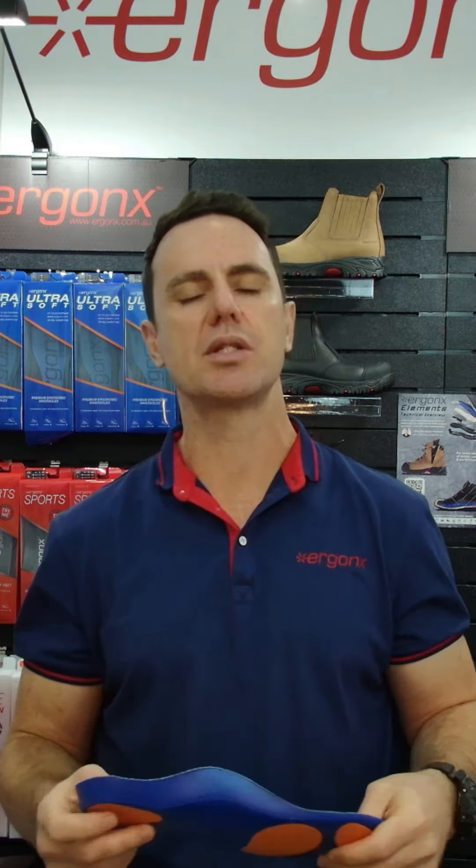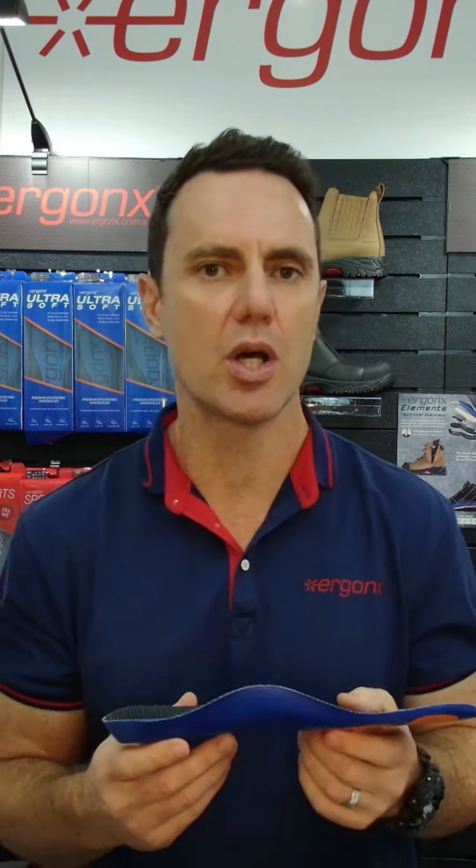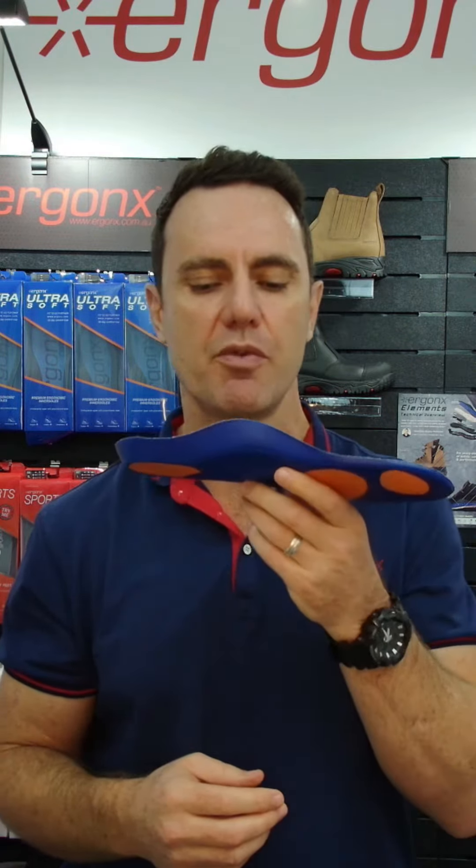How to choose the best orthotic inner sole in under one minute. Hey guys, it's Ken here and I'm the podiatrist from Docpods and Ergonx, and these are the features we look for in the podiatry clinic to help you choose the best off-the-shelf orthotic inner sole.